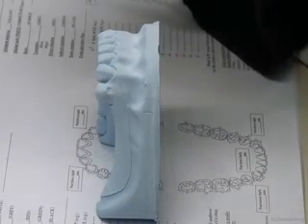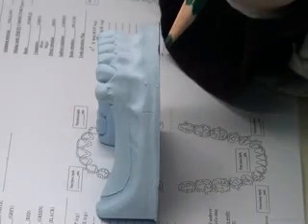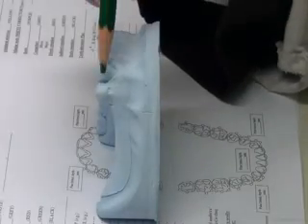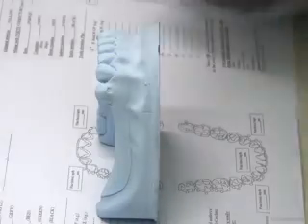For example mesial or distal. It depends on the clasp once more. Where am I going to put my clasp? If it's an I-bar, I prefer it to be in the mid-facial, slightly mesial. These are the areas of option. What will happen if I have it close to the saddle area? Distal undercut, I begin to think.